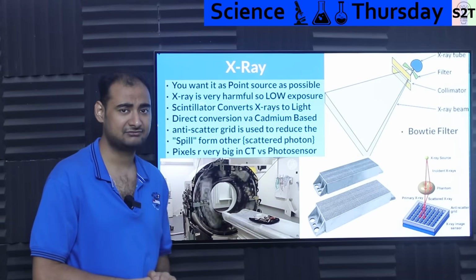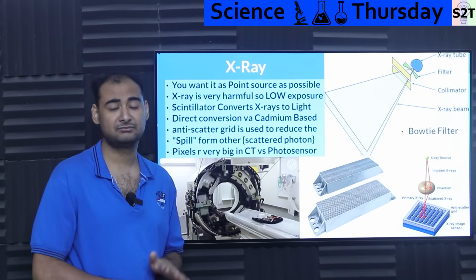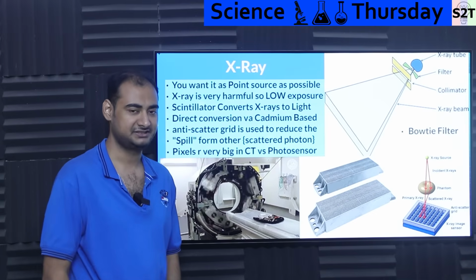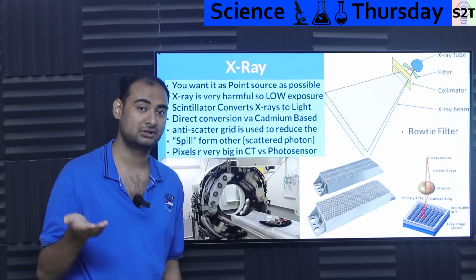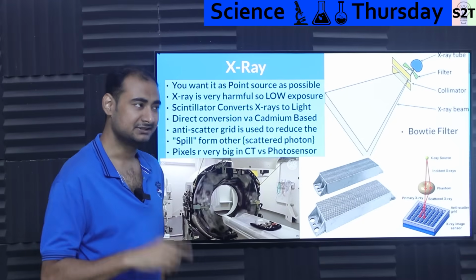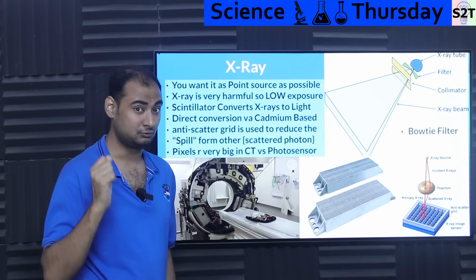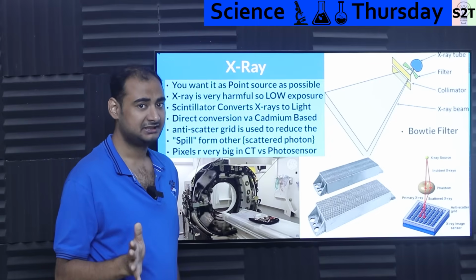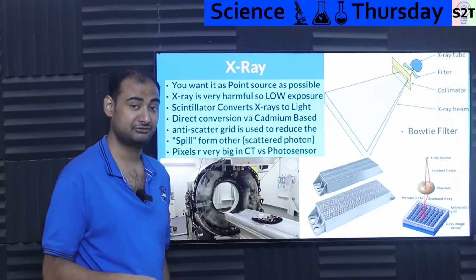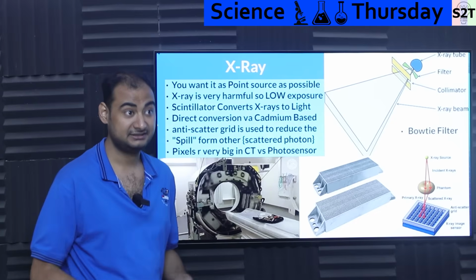The only time they will have some reservation is generally with pregnant women. From a pregnant woman's point of view, generally the technician might stop the CT scan. If she's pregnant, she has to have a good reason from doctors, not from her, about why you need a CT exactly. Generally, they will prefer her to shift to MRI. But again, then the problem is the woman has to be really good at staying still. And some people are really comfortable in MRI. I am not. Hats off to you if you can handle MRI 24/7, but I cannot. And they might have to use anesthesia. And again, that has another hassle.